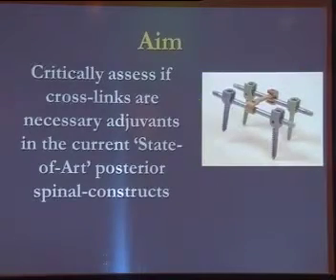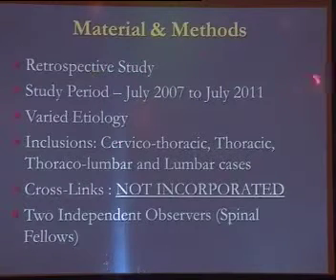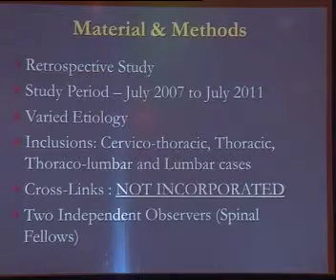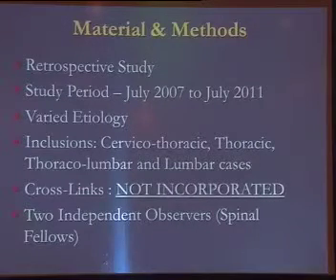So the aim of this particular study was to critically assess if crosslinks are necessary adjuvants in the current state of our posterior spinal constructs, which basically means pedicle screw rod constructs. This is a retrospective study. This is the study period, and cases belonging to various etiologies were included. These were the levels that were checked, and in none of the constructs were crosslinks incorporated.